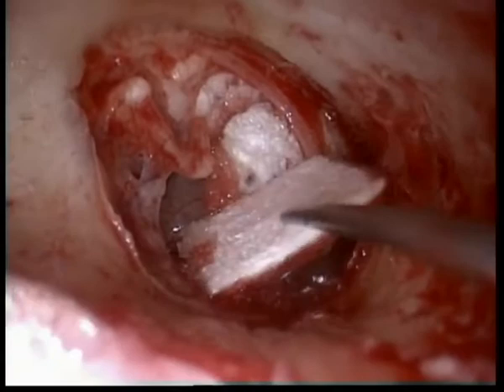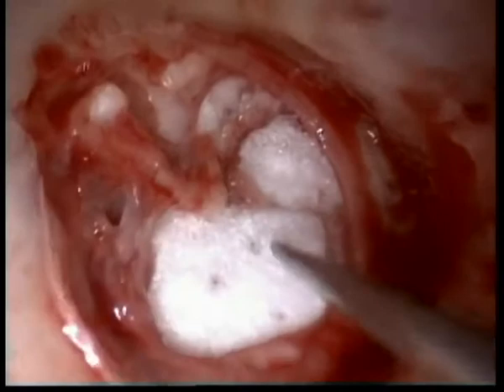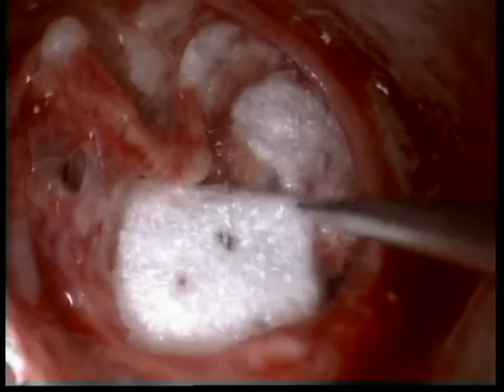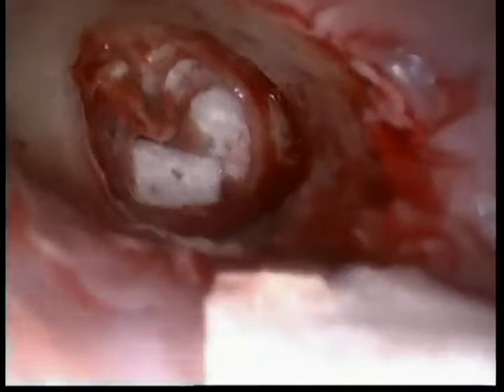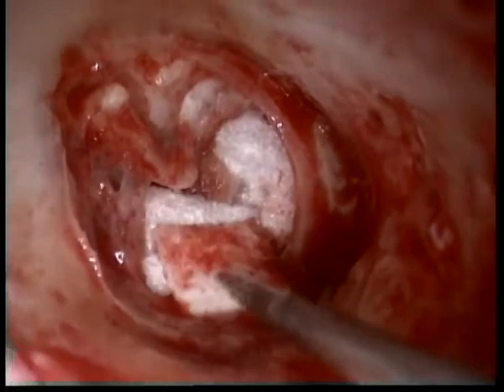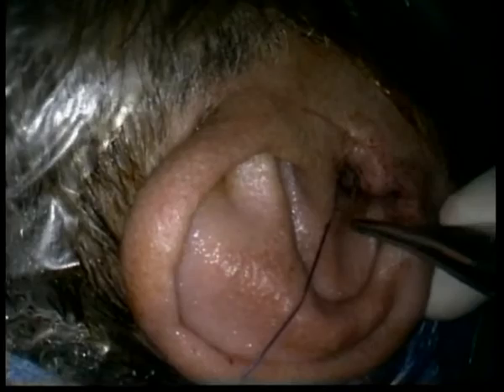And this is probably, one second. Give me smaller. I think I'm fine. Give me a tiny, tiny one. Really tiny one. Okay. I mean, tinier than this if you have one. But anyway, let me see. And give me now the graft first. Alright, the graft. And the alligator, go.